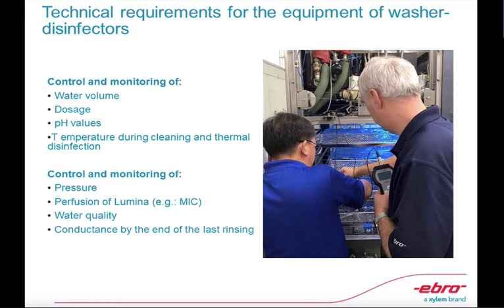And I must remind you that this was resolved and we have a solution with a wireless conductivity logger.